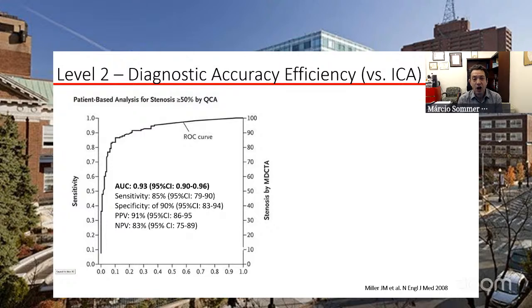So I'm not sure all the wrongs from CT are necessarily CT's wrong, versus invasive angiography also being wrong, because the definition of what's really the disease we're looking for has been changing over time, and there's no real gold standard to define what we're looking for. We might be looking for plaque, we might be looking for ischemia, ischemia correlating with symptoms, flow gradients on the lesions, etc. So it's a little gray.